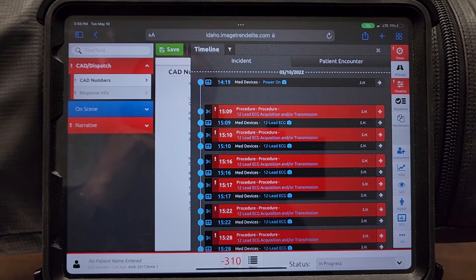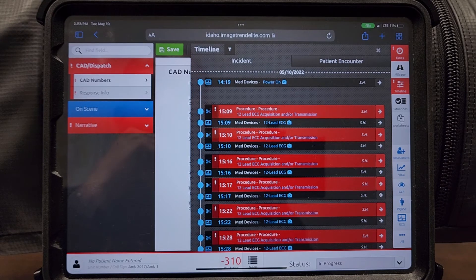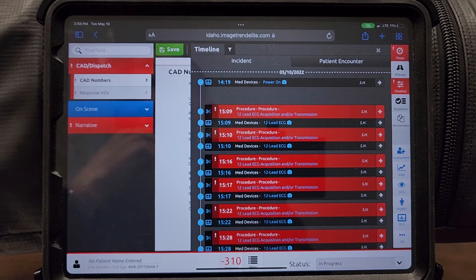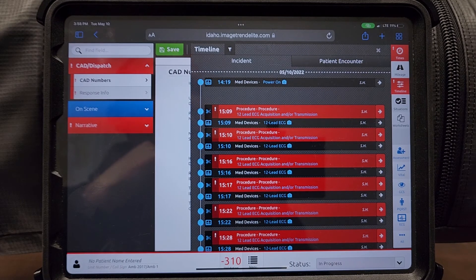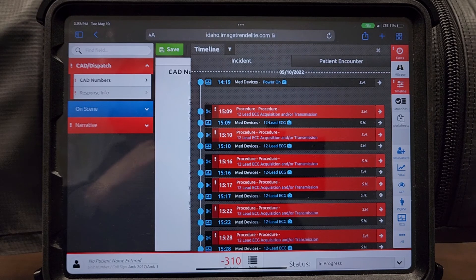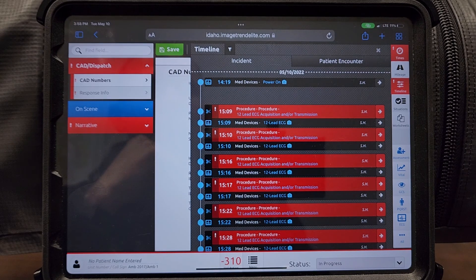You'll have to go into your charting software — into Image Trend, Idaho Image Trend — and you'll have to then go and edit your vital signs, get rid of vital signs that only contain a heart rate, and clean up your chart.